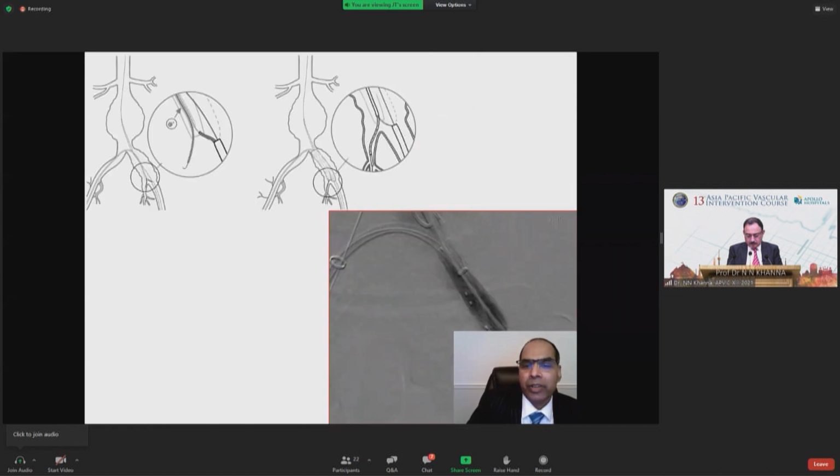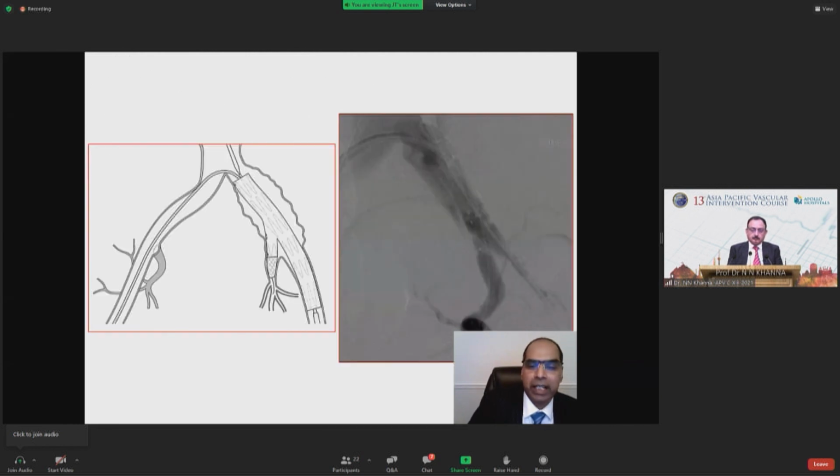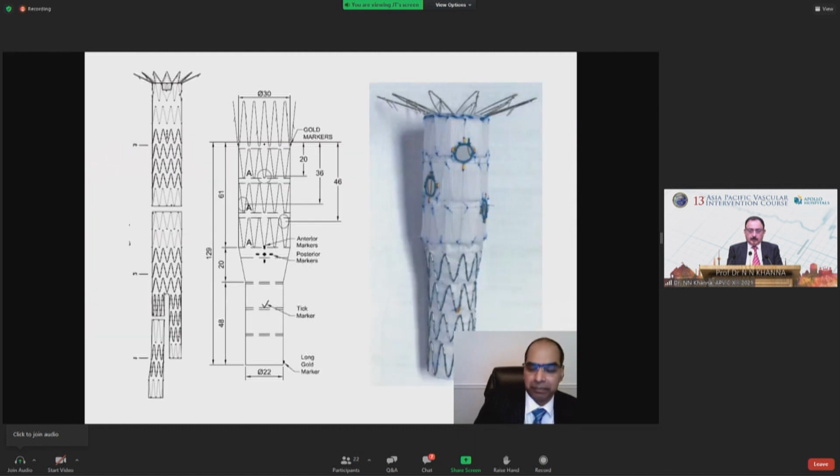And then you track the target vessel stent quite frequently with Cook system. This is Atrium, Advanta Atrium, which is a balloon expandable stent with 2 layers of PTFE, and once that is placed into the internal iliac artery, the through wire is removed and the internal iliac artery branch is expanded, and deployment of the external iliac component is completed, followed by removal of the delivery system.